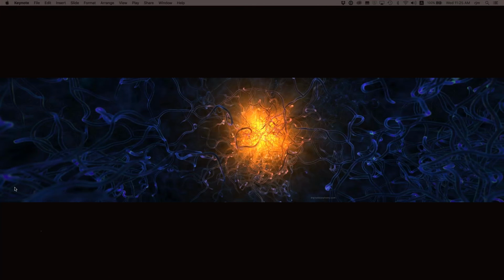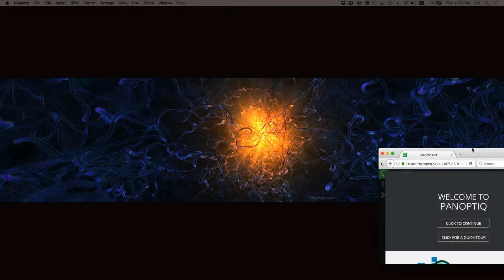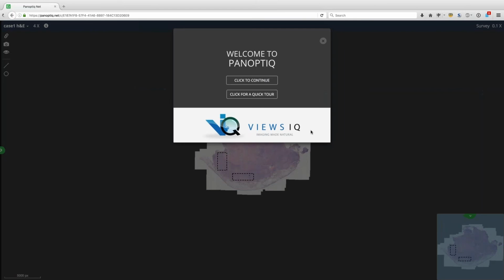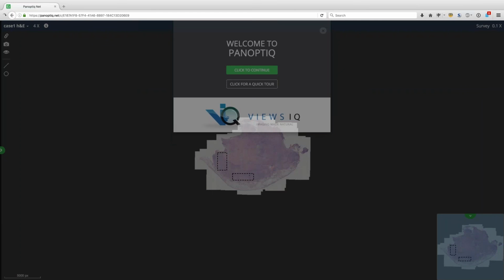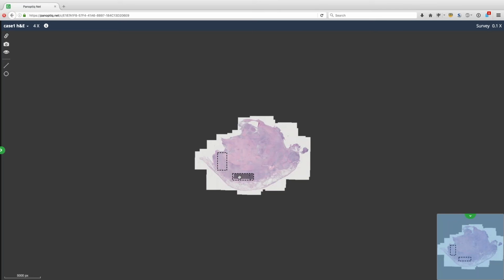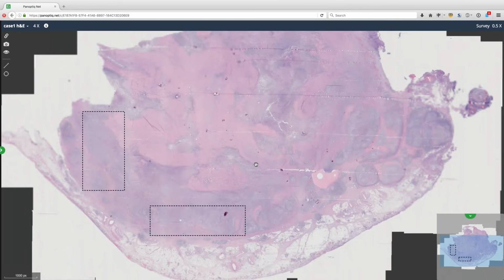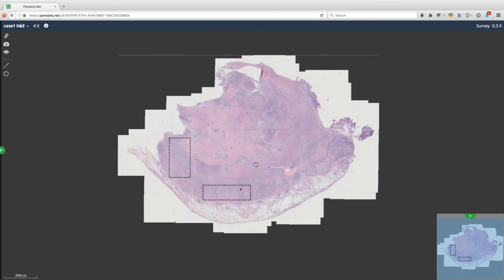The patient was then referred to a cardiothoracic surgeon who looked at the scans, confirmed what they clinically thought was a thymic cyst or a cystic lesion, and then proceeded to excise it during surgery. So this is a representative image of what we received in pathology. The first thing that strikes you is that this is not a very cystic lesion. It's actually pretty solid.